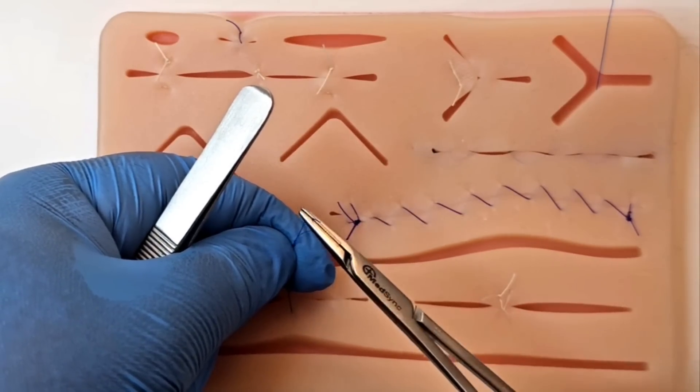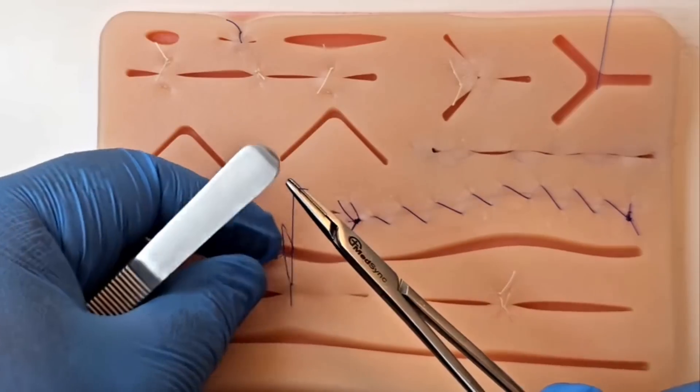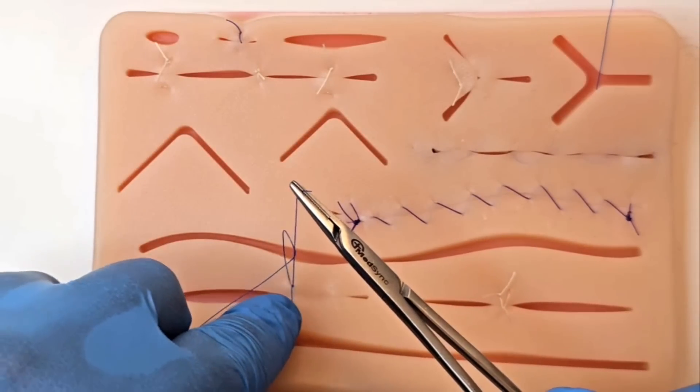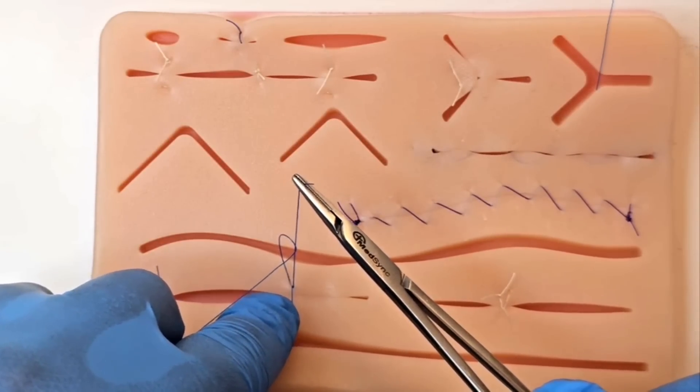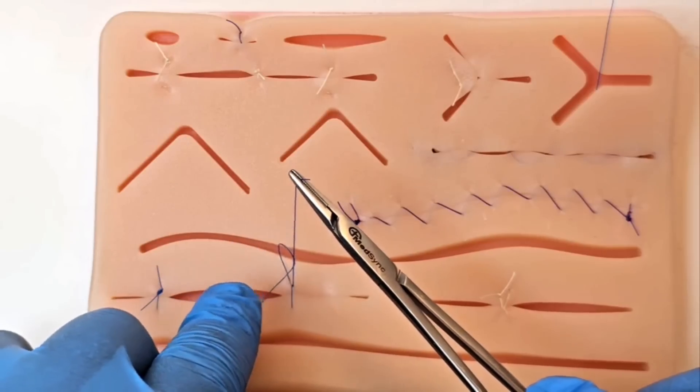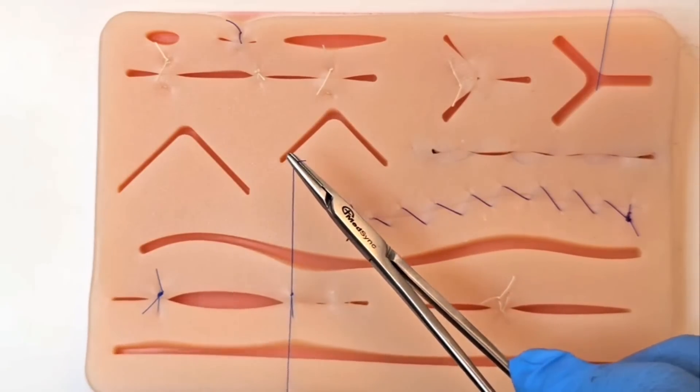Now take the tension onto the short suture, ensuring that your knot is still approximated. When you're happy, slide the long suture down and secure your knot.